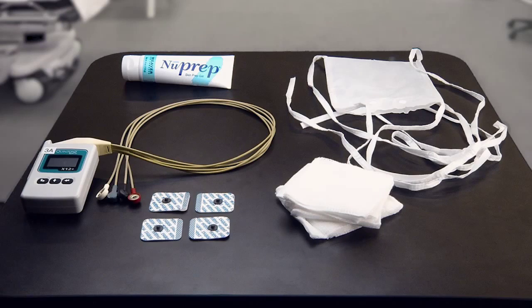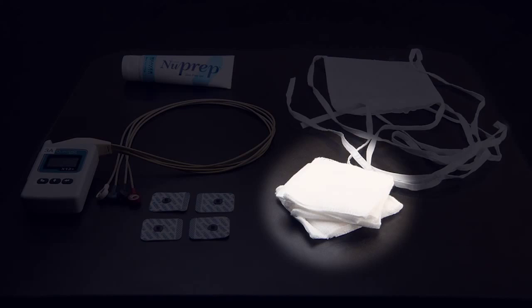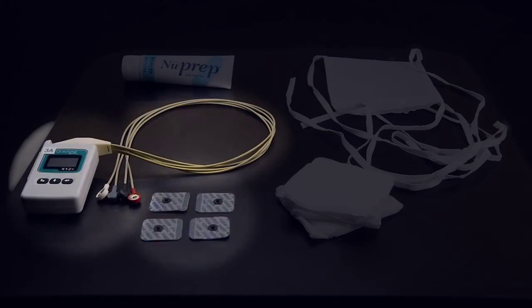This way we can do an electrocardiogram for the entire time he's here. You'll find this equipment in our locker room. We have the new prep, the pouch, the 4x4s, the electrodes, and our heart monitor.